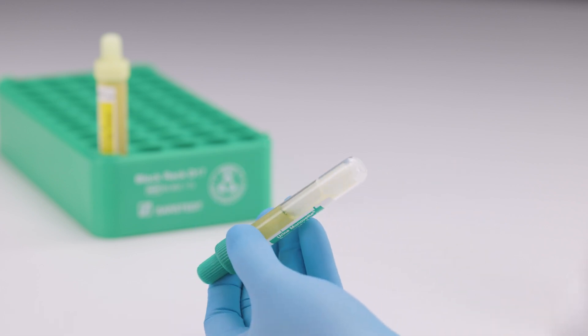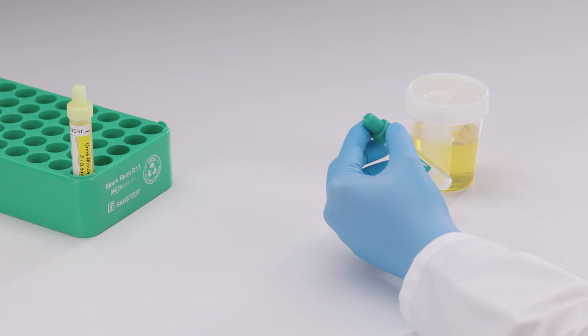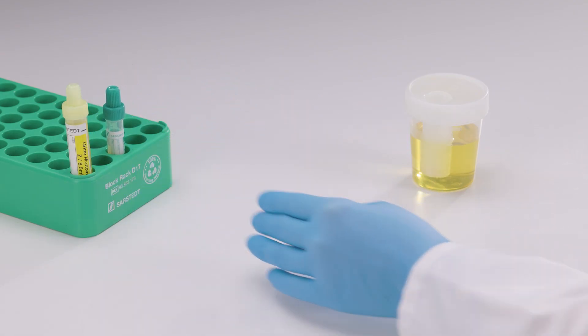Invert the urine monovette boric acid around five times or until the boric acid is completely dissolved.